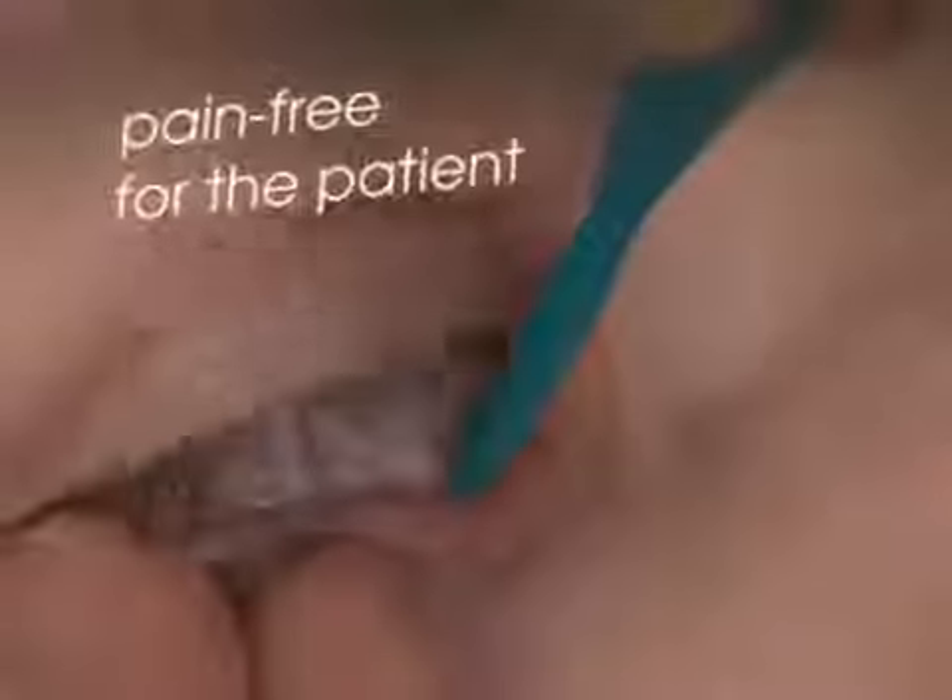This totally innovative concept of a plug stretched on a plug inserter means that dilation is not required in most cases — good news for patients since this step can be painful. There is no need to use forceps or to administer topical anesthesia.